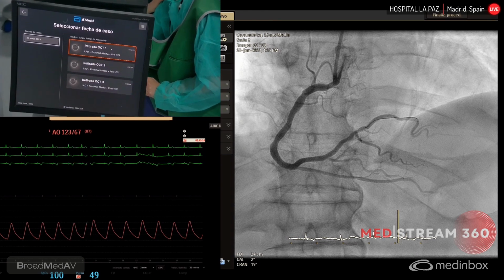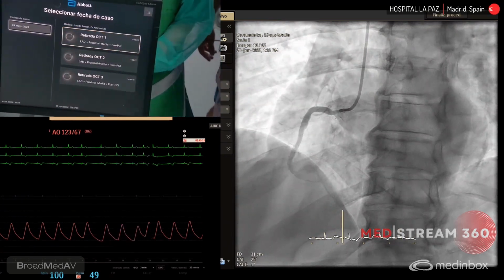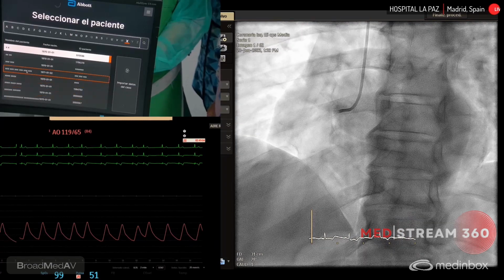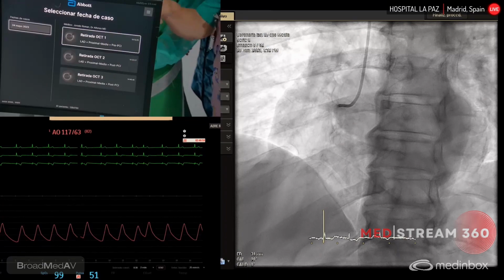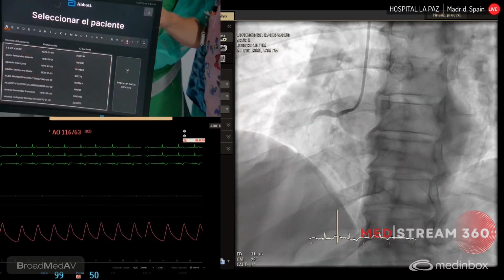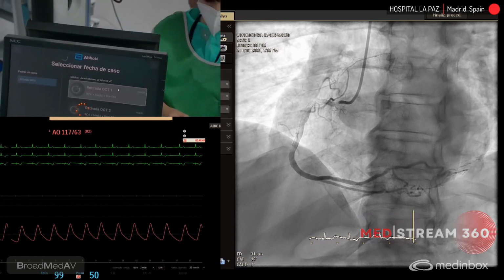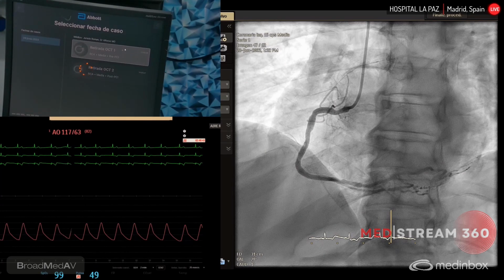The stent with OCT was quite malapposed, especially in the proximal part. You can see in the angio that there is an aneurysmatic zone in the mid part of the stent. And this one obviously is malapposed, and also the proximal part. So we decided not to post-dilate in the previous procedure because the thrombus burden was quite high, and in order to reduce the no-reflow phenomenon.